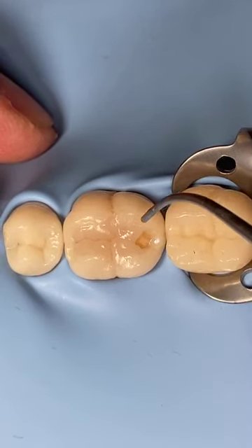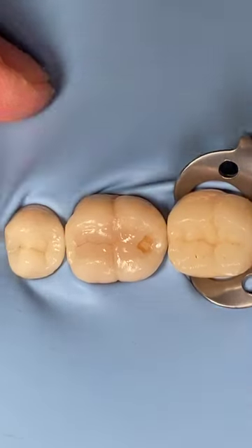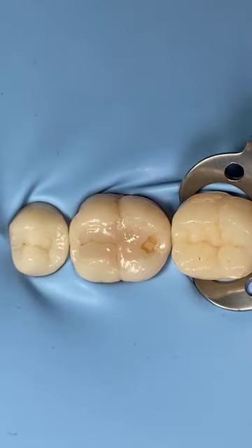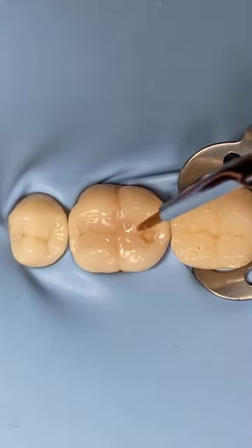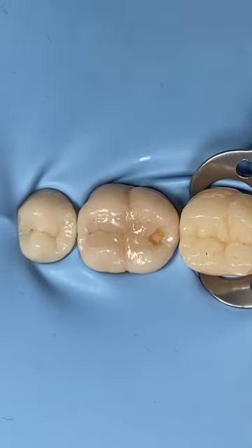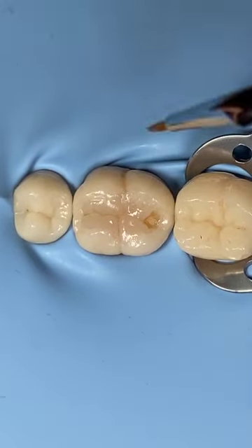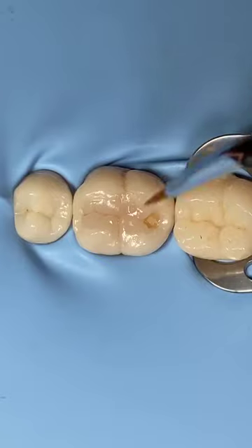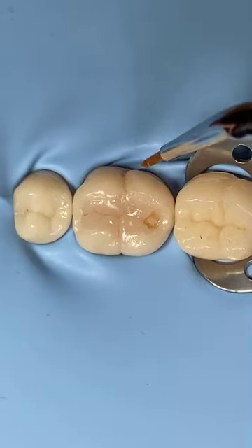Yeah, this is the first molar. Remember, 5 layers. Okay. How about the second step? The second step is very easy. All you need is your magic brush, dipped in the modeling liquid or a bit of bonding. A very thin layer of bonding, and make it well adapted. This is very important, you know.